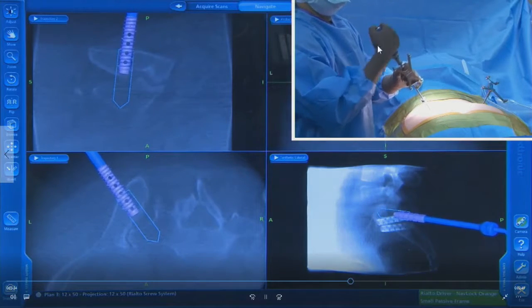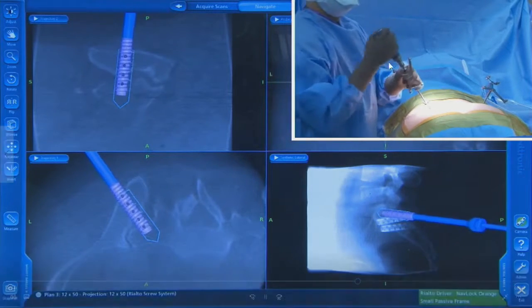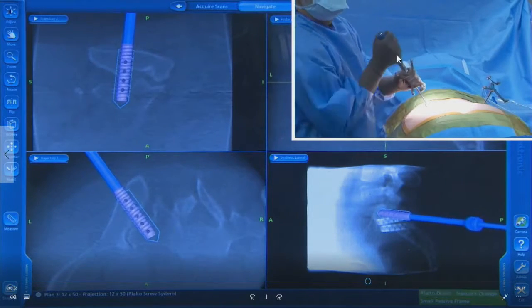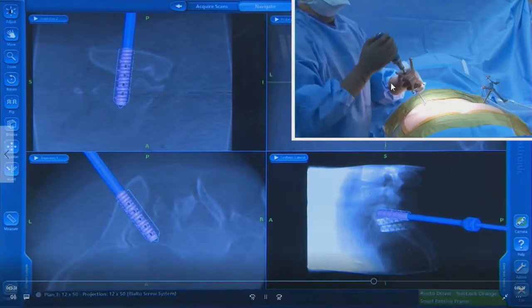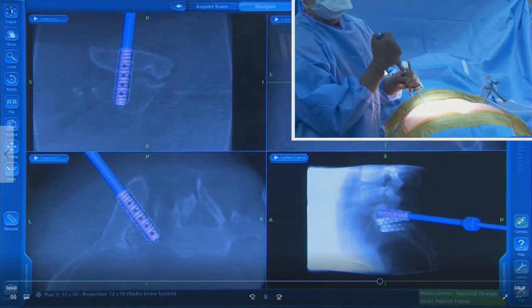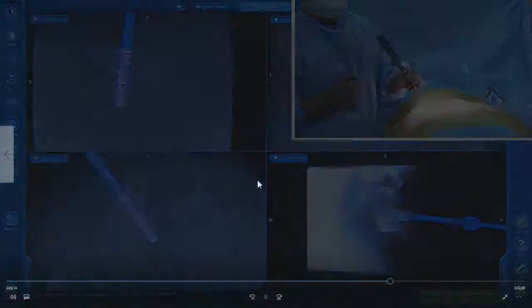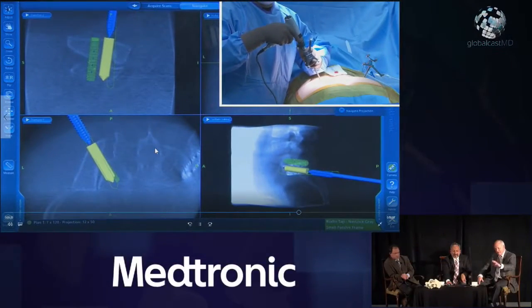Take a look at my wrist — as I cross the cortices you may see a little more effort on my part. And then as we get to the very bottom, the anterior alar cortex, you're going to see me start to struggle as I bring that implant right up against — not across — that anterior cortex. This implant really has wonderful purchase. I compliment you because the implant is not proud proximally or distally; it's sitting perfect.